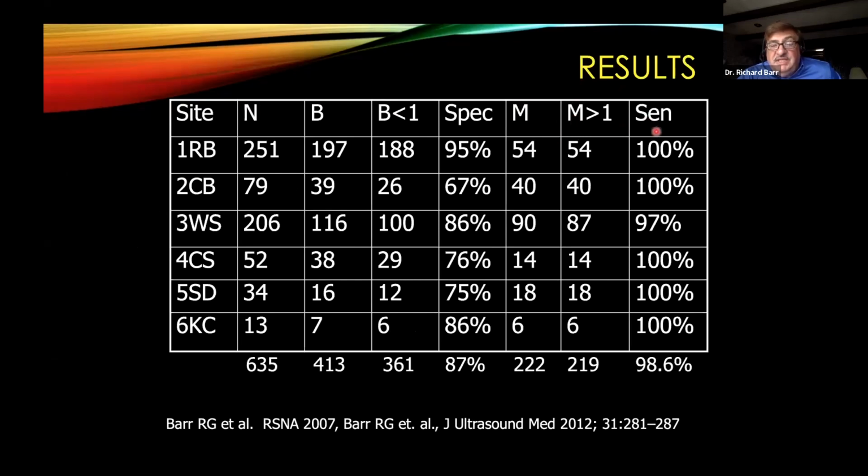You'll notice that the sensitivity of 5 of the 6 sites was 100%, and 1 site was 97%. So overall, 99% sensitivity. The 3 misses at this site actually were cases of DCIS and invasive lobular cancer, where we think the lesion on B mode was not measured properly. So that is one of the limiting factors in using this technique: you have to be able to measure the lesion well in B mode as well as in elastography.